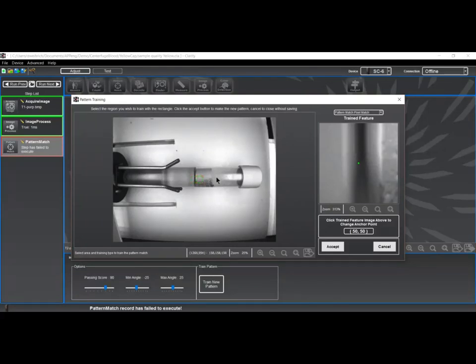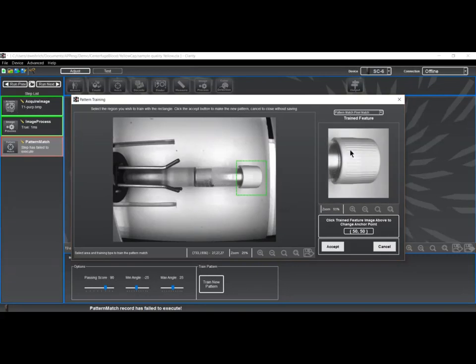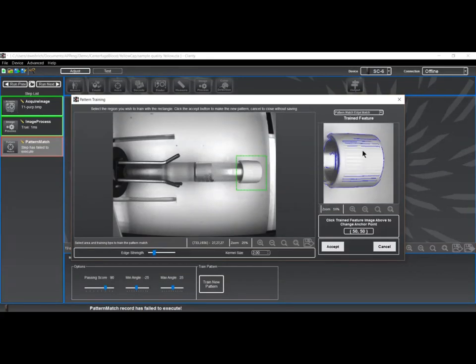What comes up initially in a pattern match step is the picture, and now we're finding a training area. So what we're going to do is train on the edge of this cap here. We're going to use an edge match because the pixel match is just too involved with getting to exact shading from one picture to the next. Edge match is a lot more forgiving. And of course we have edge strength measurement. So we just basically want the outline of the cap here to be our guide, so we can adjust appropriately.